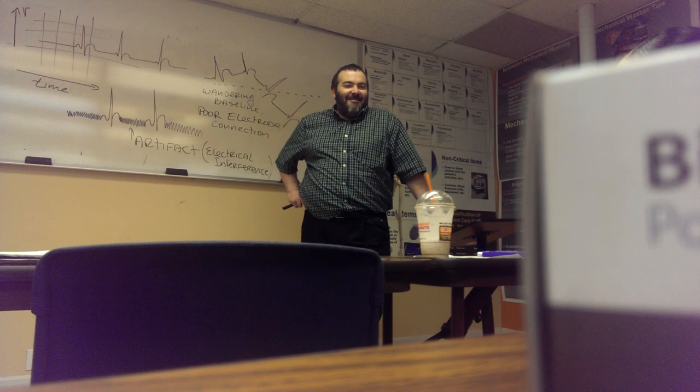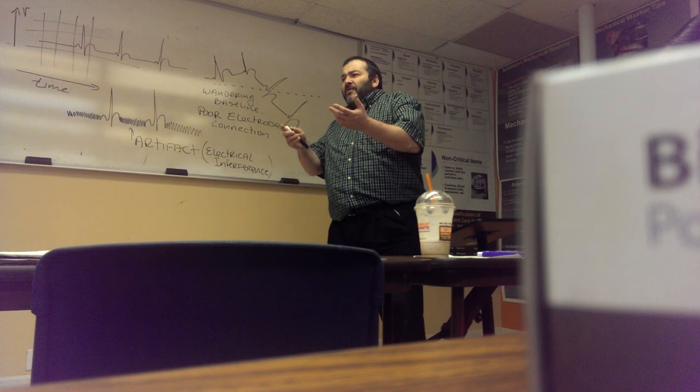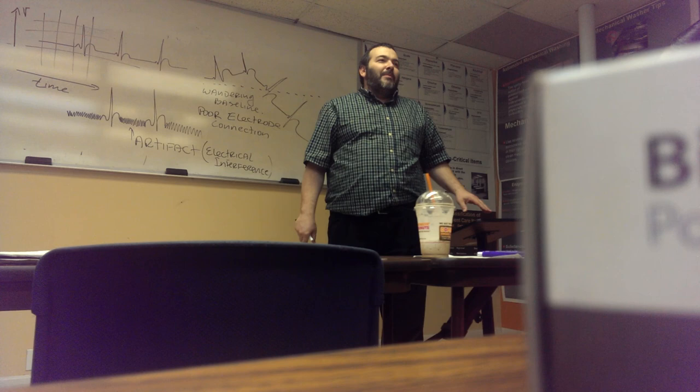So this 40-year-old lady is in the doctor's office, and I'm 19 doing an EKG on her. And I'm getting this artifact. I got rid of the pagers. Back then, no cell phones. Pagers. Okay? I turned off the lights, as many as I could. I made sure that no radio or TV was working anywhere. And still, I'm getting an artifact.